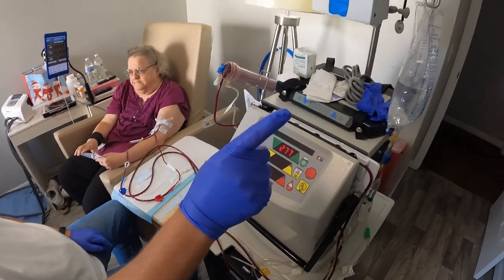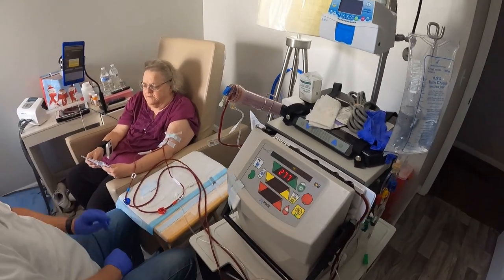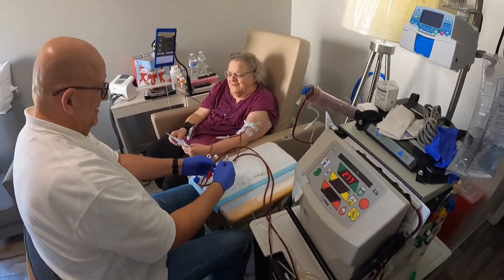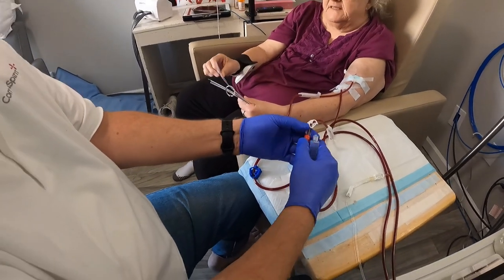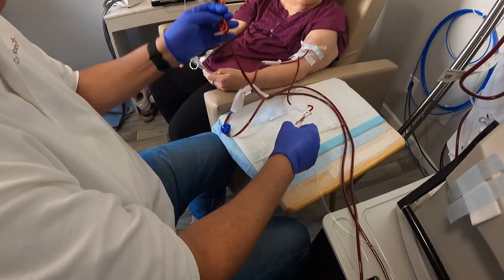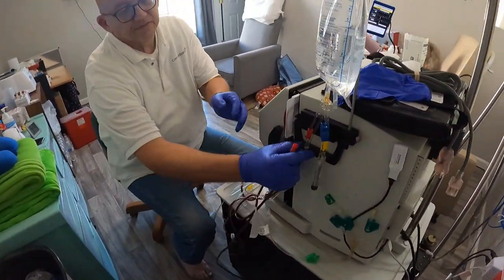You'll notice that they asked us to make sure we had 300 up here. That's why. So you're about to see that go down, a countdown as we're clearing it. Remove the saline syringe from under the red clamp, which he always does out of order, but that's all right. Clamp both red arterial needle clamps. Disconnect the red arterial line from the needle and connect the saline syringe to the needle. We did that before. Connect the red arterial line to the red clamp under the saline bag, just right back where it came from.